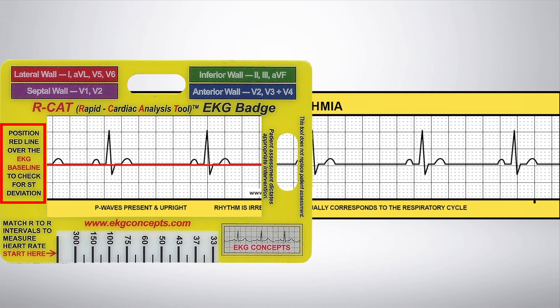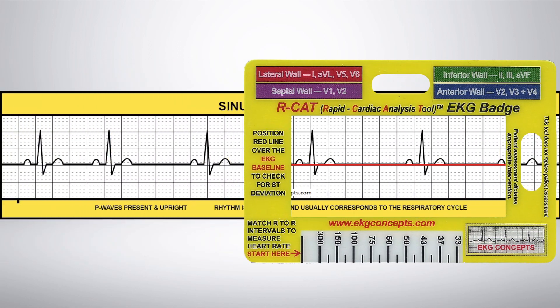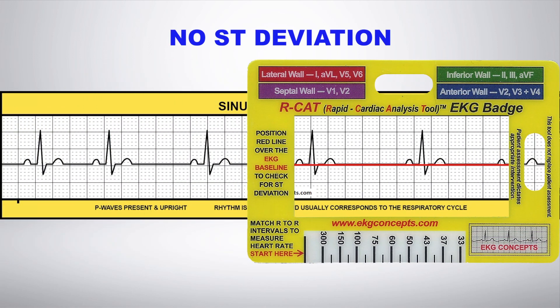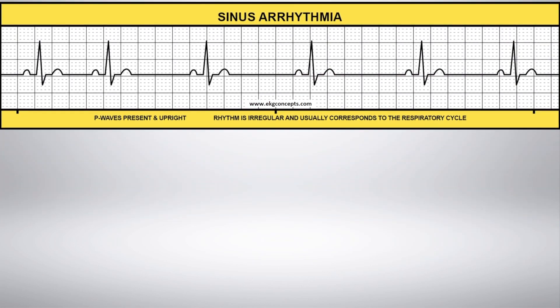Position the EKG badge to slide the red line along the baseline to look for ST deviation. There is no ST deviation. All of the P waves are present and upright.